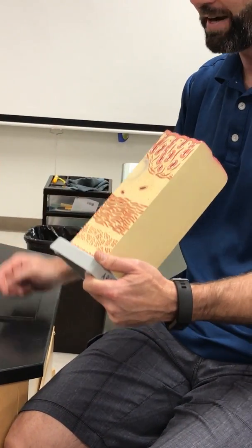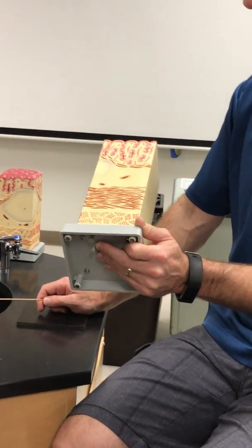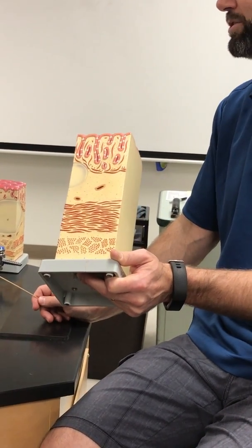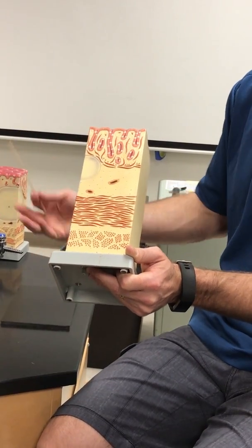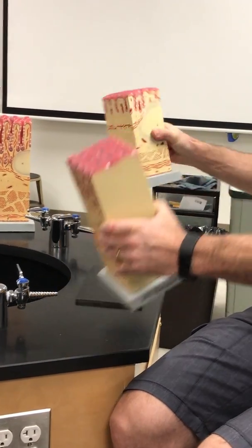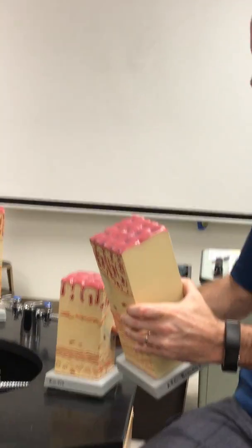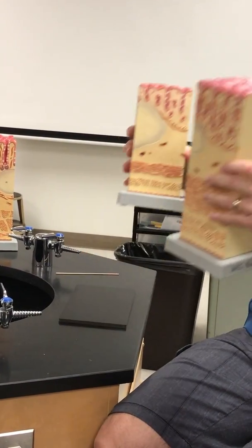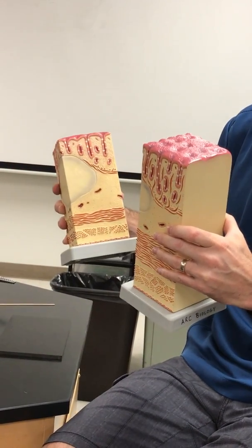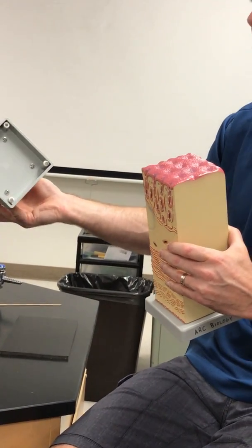Follicles don't help too much because they're everywhere. Unless you happen to see a huge follicle or a huge collection of follicles, then that could mean you're in the ileum of the small intestine if you had villi, or it could mean that you're in the appendix, an outpocketing of the large intestine. So then there's another one that looks like that. And it's shorter, so the wall is thinner. And then what's the other big difference here? Huge follicle. So we know it's part of the large intestine. Thinner wall, but a huge follicle, so it must be appendix.